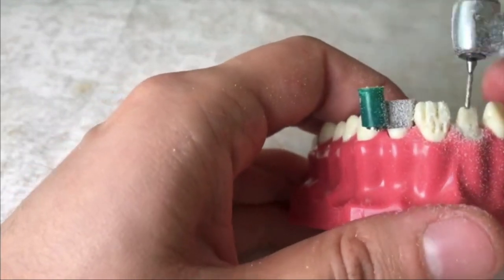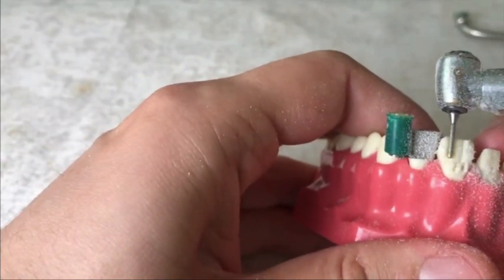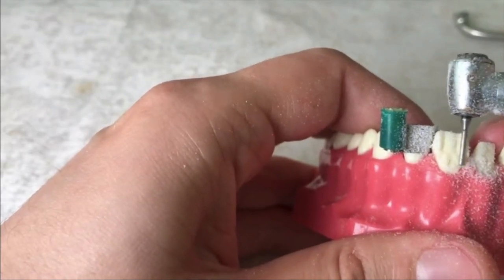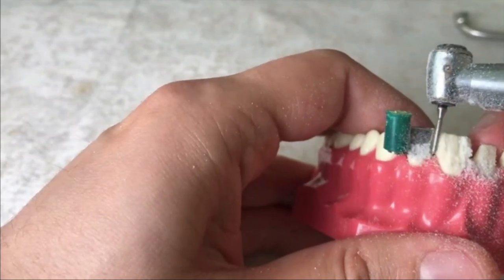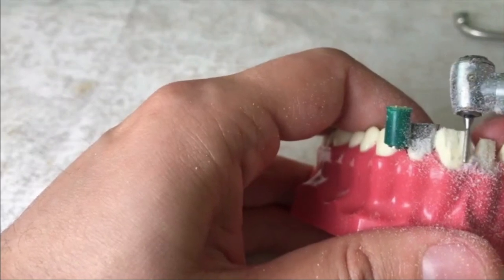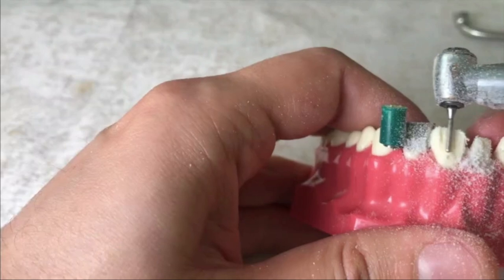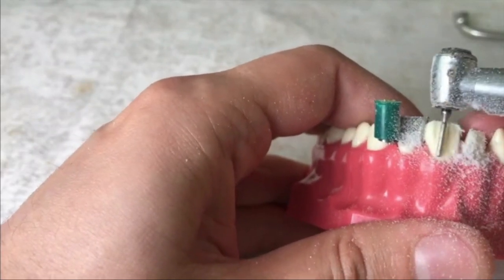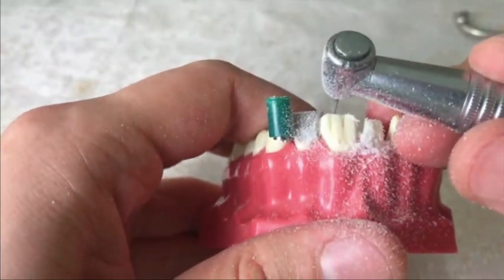After joining the grooves on the buccal face and forming a smooth surface, I will start to prepare the incisal face. I also make grooves on the incisal face and join these grooves.